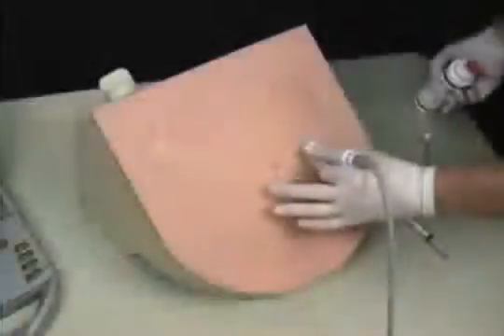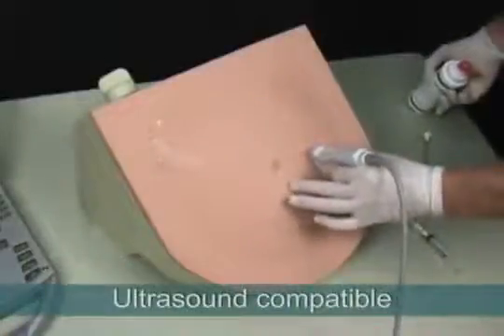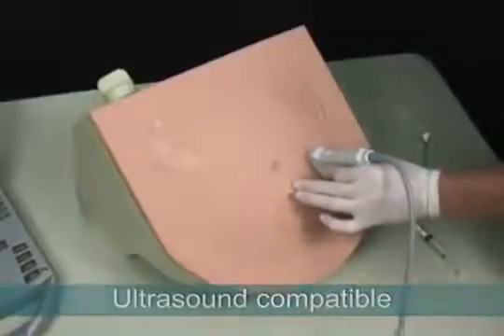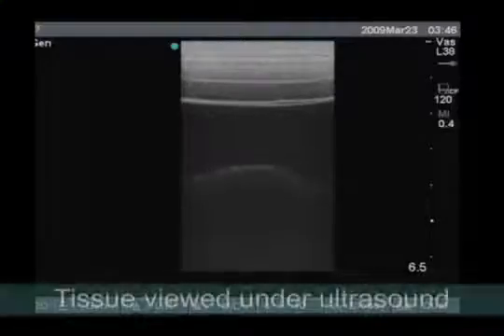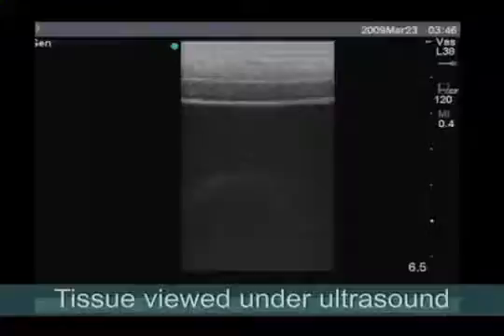When using ultrasound with the model, the user will be able to determine the distance from the skin to the fluid, and the distance to the midpoint of the collection.